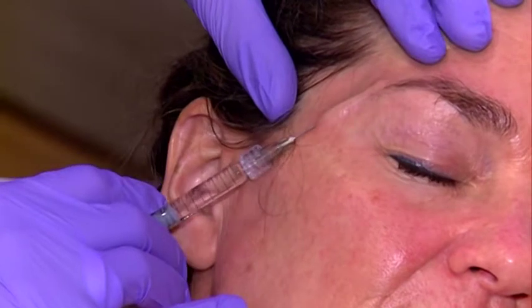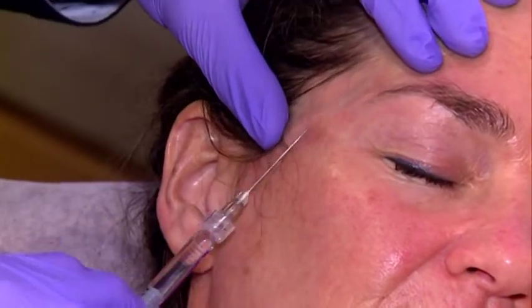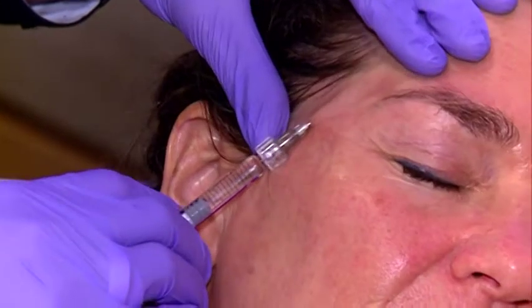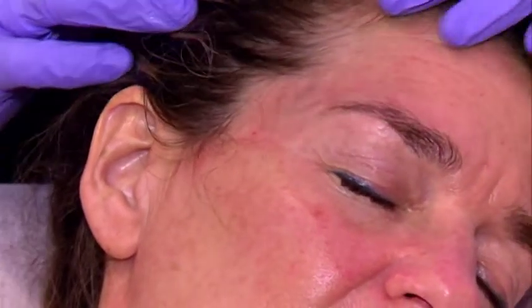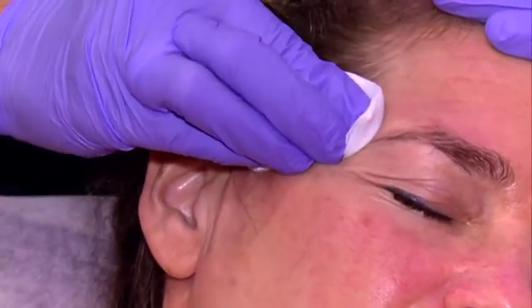Okay? And now I'm giving a little bit of product and augmenting it. So 22 gauge cannula, and you're using volume at the moment? Yes, I'm using volume, little threads, and I'm doing a little bit irregular for you. You see the irregularities? Is the lighting good, or do you want it darker? Can I get a gauze? Yes. Can we make it darker? And now I'm massaging it.